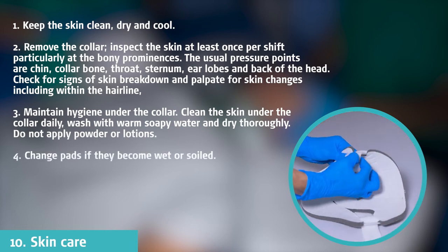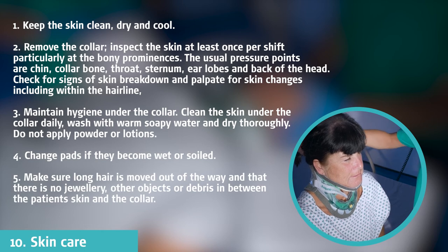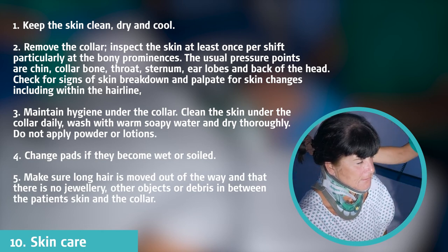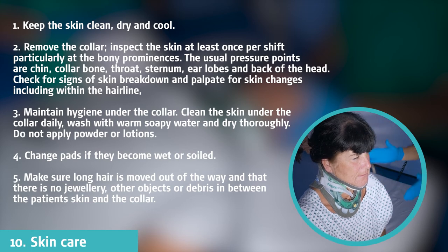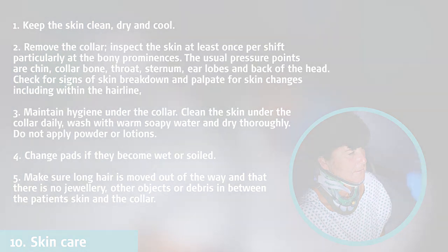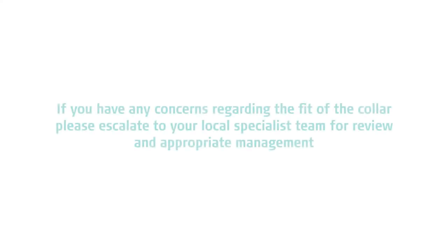Change the pads if they become wet or soiled. Make sure long hair is moved out of the way and that there is no jewellery, other objects, or debris in between the patient's skin and the collar. If you have any concerns regarding the fit of the collar, please escalate to your local specialist team for review and appropriate management.